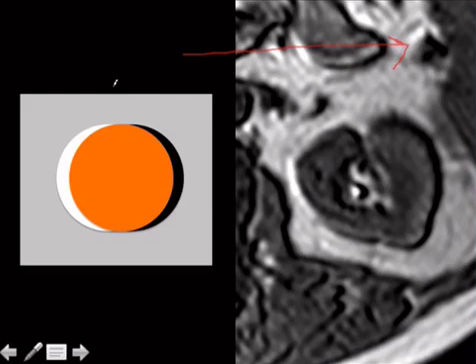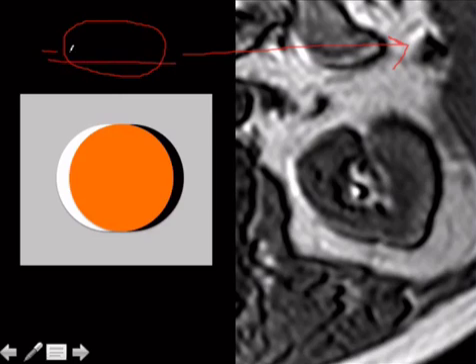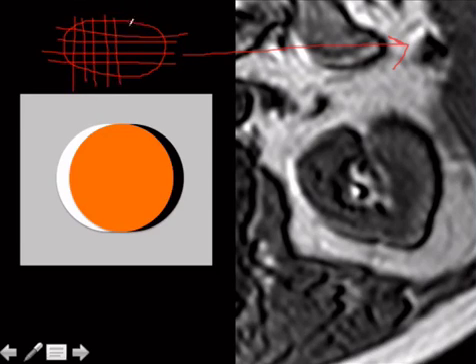And by convention for abdominal imaging, so here's an abdomen, the phase encoding direction is this, because that's fewer cuts, and the frequency encoding direction is this, because it's more cuts. So that is the frequency encoding direction. Now, obviously you can switch that, but by convention, for an abdomen, that's the direction it's going to be.